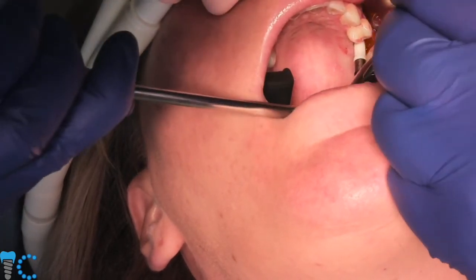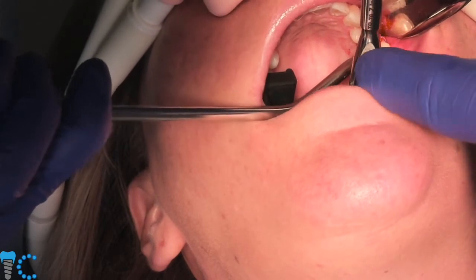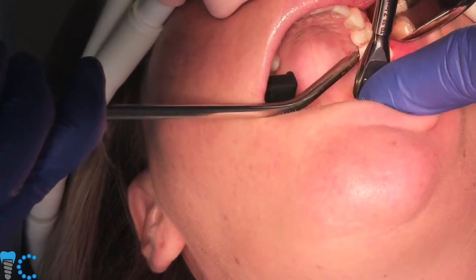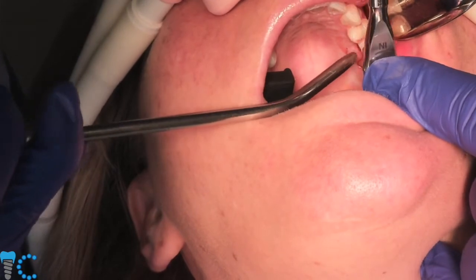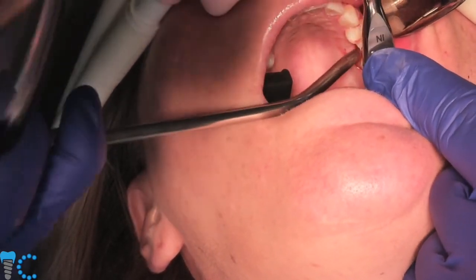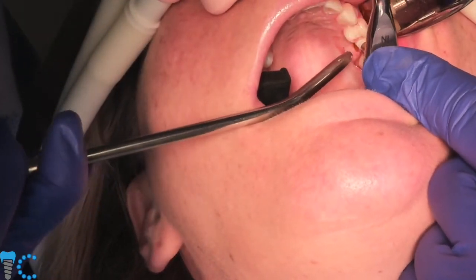And I'm just going to transfer this to the mouth, and now here on this side of the ratchet I should be reading "in." It should say "in," and I'm going to hold my finger right there and put a little bit of pressure on it, and make sure we're going in at the right angle here.